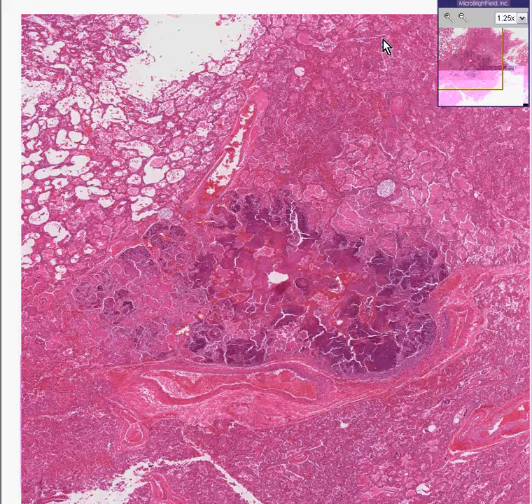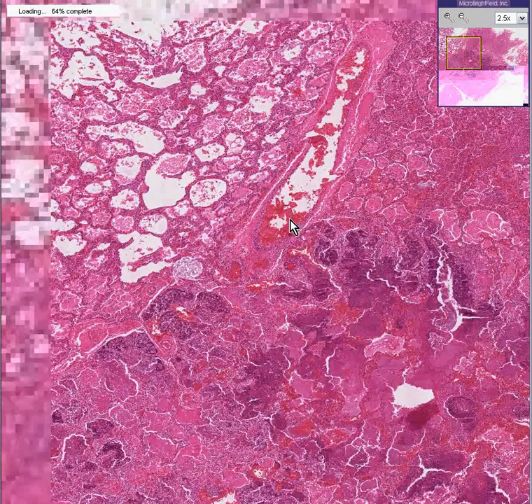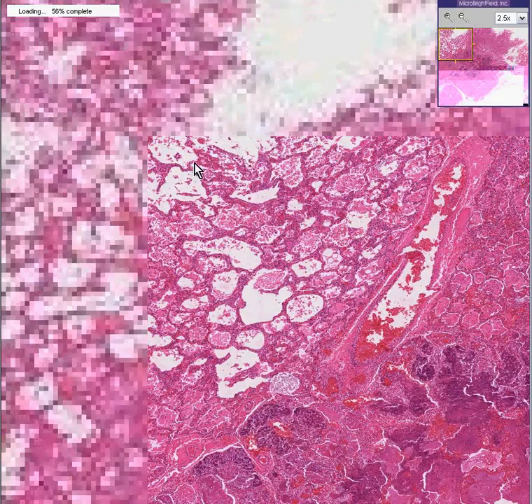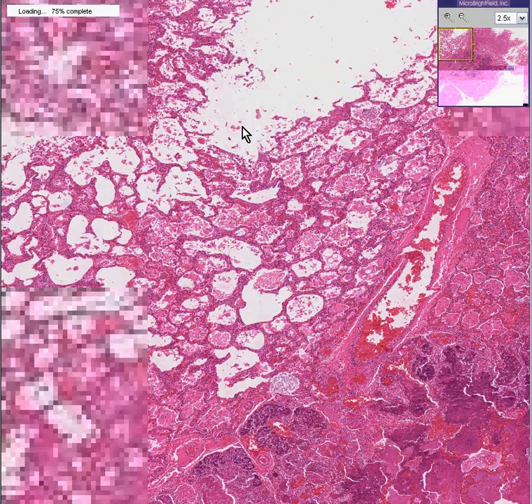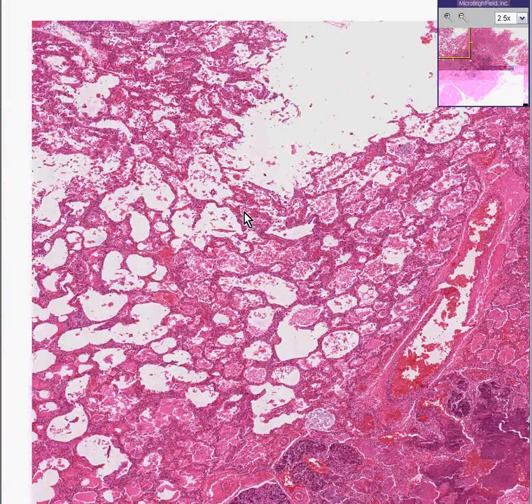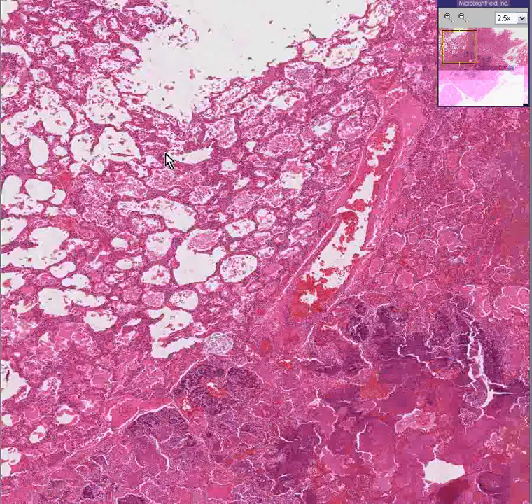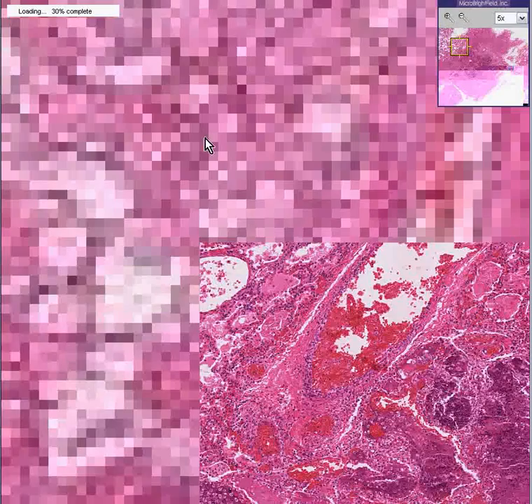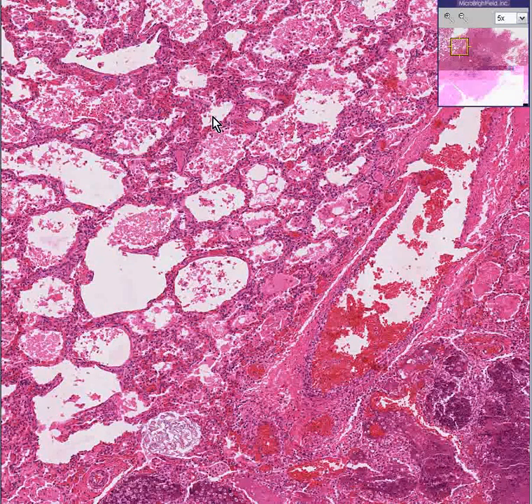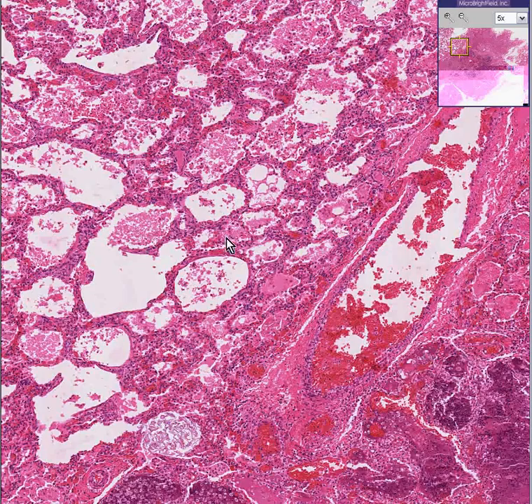I know I could very quickly convince you this is a lung because in some areas, like out here, you could recognize alveoli. In fact, you could recognize alveoli that have air in them. What you can also recognize very quickly is that it's a very hyperemic lung. And in addition, some of these alveoli are filled with fluid and proteinaceous material.